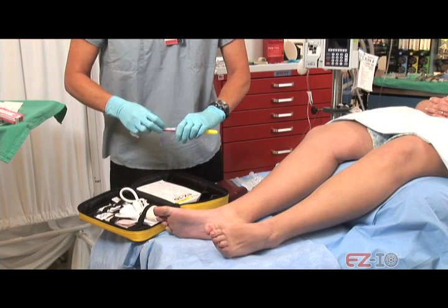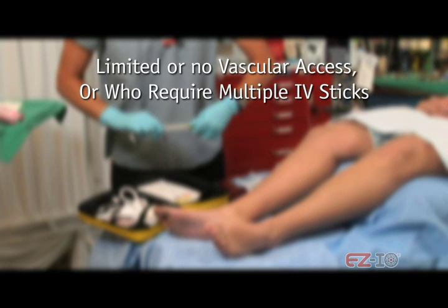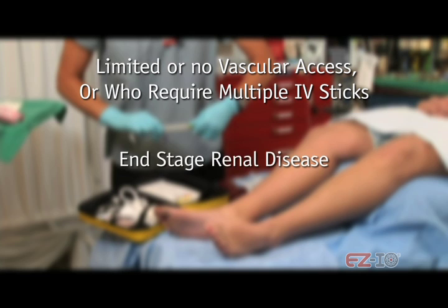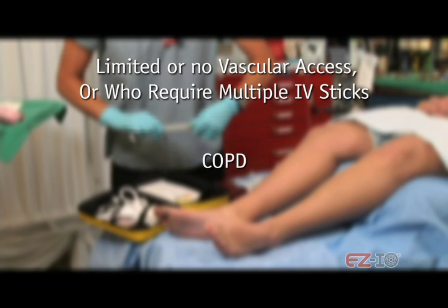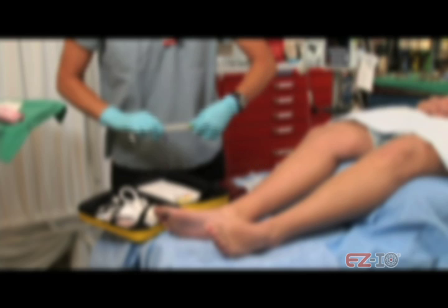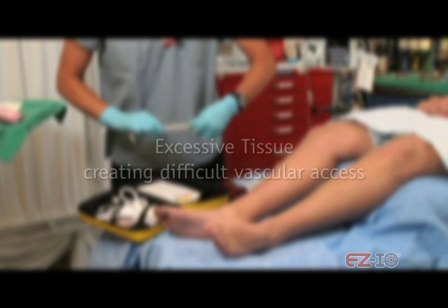Examples of patients who could benefit from IO access include, but are not limited to, patients with limited or no vascular access, or who require multiple IV sticks, such as diabetes, end-stage renal disease, cancer, cardiovascular diseases, HIV/AIDS, multiple sclerosis, hemophilia, cystic fibrosis, rheumatoid arthritis, Crohn's disease, ulcerative colitis, COPD, drug abuse and addiction, as well as major trauma, cardiac or respiratory arrest, sepsis, or excessive tissue, creating difficult vascular access.